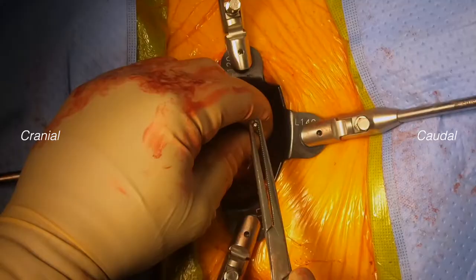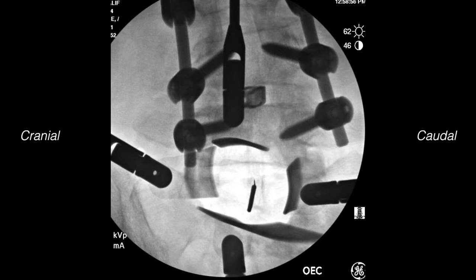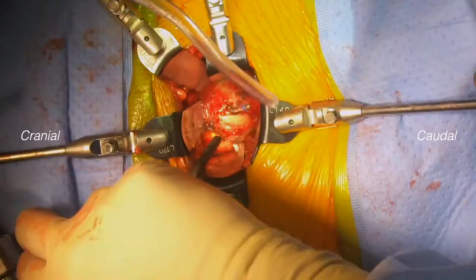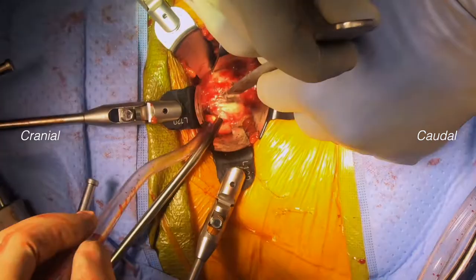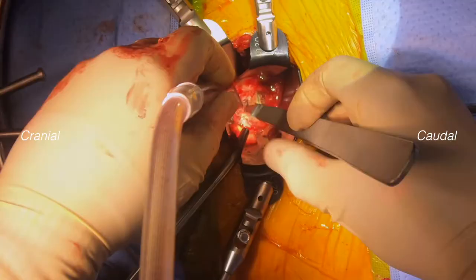We place a long bovie tip in the center of the L5-S1 disc and take an AP fluoro spot to confirm midline. Next, we incise the anterior annulus of L5-S1 to perform a box annulotomy to make space for the cage that we will be placing.